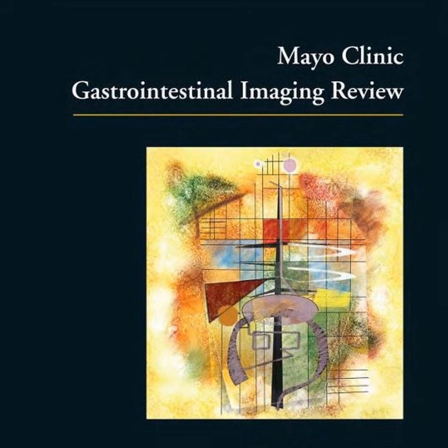Oh, completely. It all comes down to fluid signaling. Yeah, on heavily T2-weighted, fat-suppressed MRI sequences, the fluid within an active fistula tract or an abscess cavity is going to exhibit hyperintense signaling. It essentially lights up bright white against the suppressed, dark background of the pelvic fat and muscle. A CT scan simply cannot provide that level of soft tissue contrast. It can't. MRI allows the surgeon to literally trace the exact anatomical path of the fistula right through the sphincter complex before they ever make an incision. It's mapping the pathology with physics.